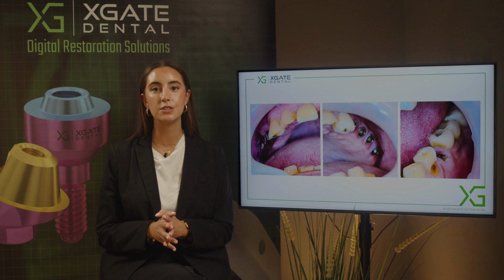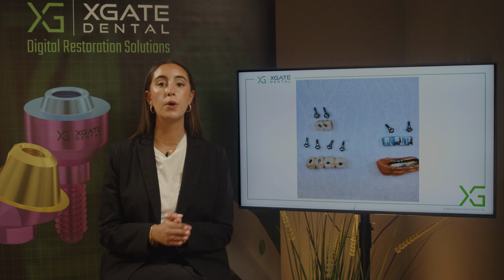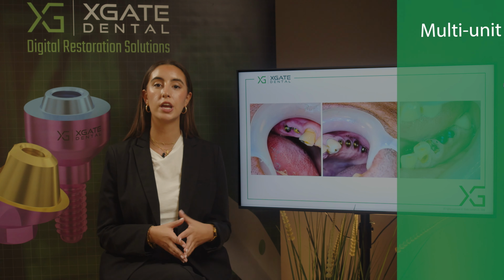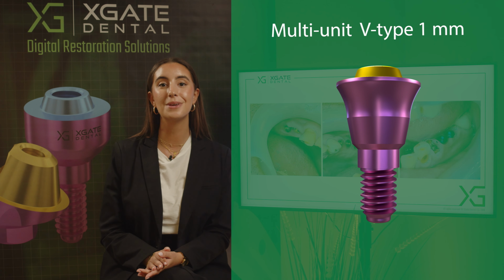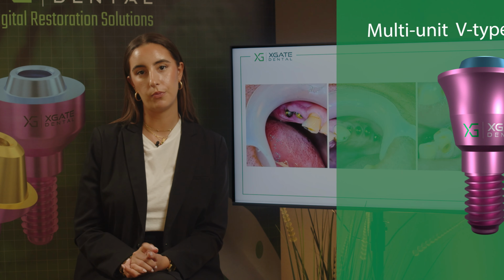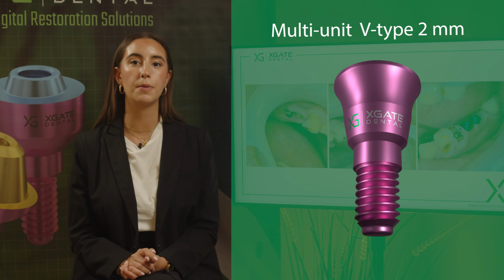First of all, what we did is we changed the multi-units, because the multi-units that were used, probably we can't even get them anymore, and we don't know what type of multi-units they even were. So we changed it to new ones that we know what type of multi-units they are, and we can make all the construction on those new multi-units. It fits because we know what type of implant we had, so we can choose the multi-units for this platform and this type of implant.